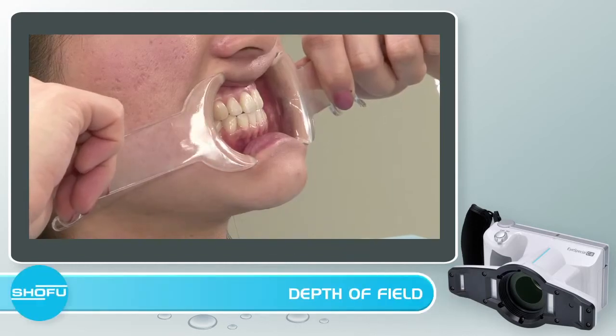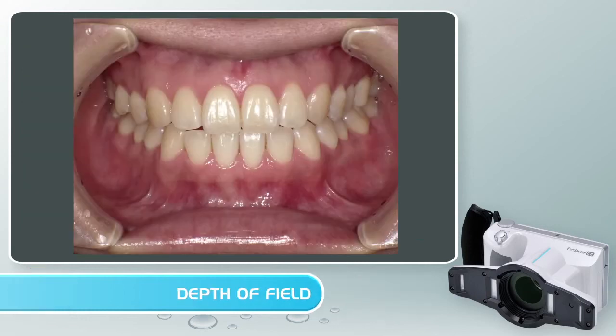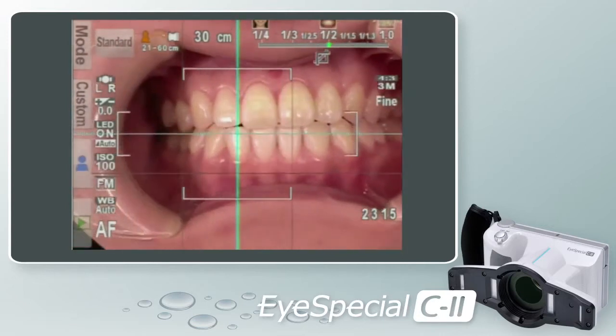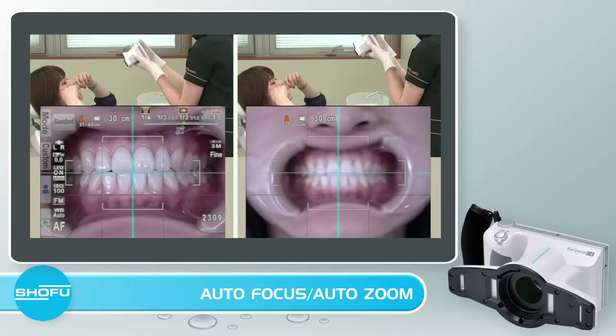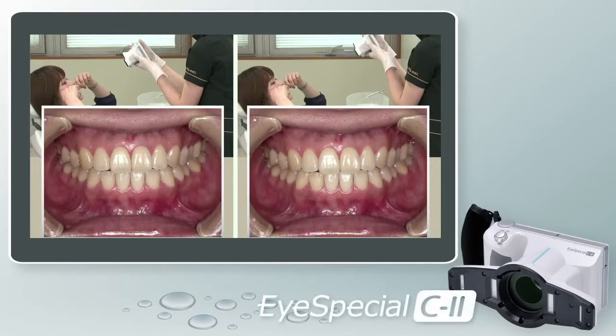An important aspect of getting a clear shot, particularly a retracted smile, is the depth of field. The iSpecial C2 has exceptional depth of field range. Many other cameras modified for dentistry do not have adequate depth of field, thus casting a shadow or causing the posterior teeth to appear blurry. The iSpecial C2 has smart autofocus and auto-zoom capabilities built in. If the camera is out of range, the auto-trimming function will pull the image into the frame as the picture is taken, ensuring consistent and reproducible images with no special photography skills required.